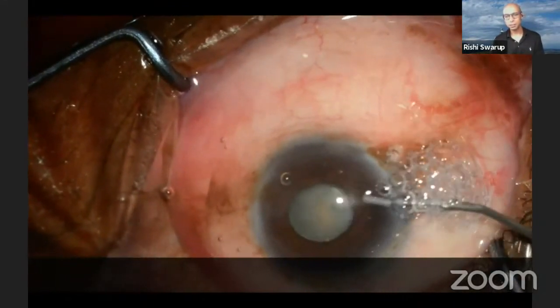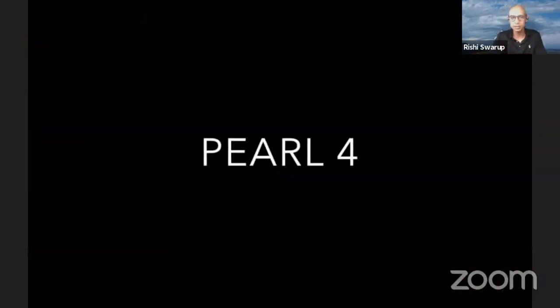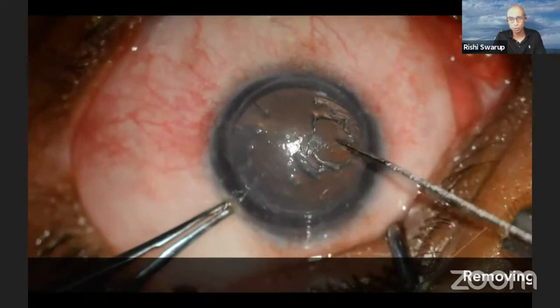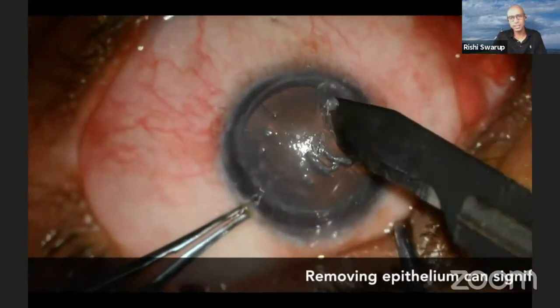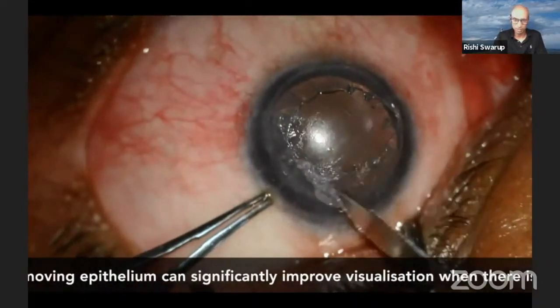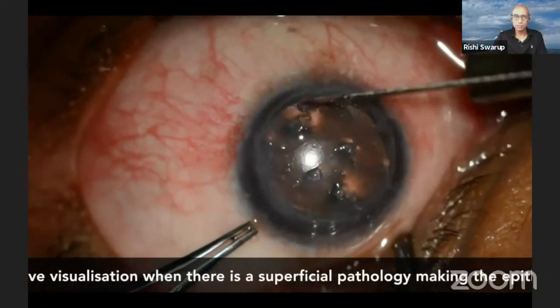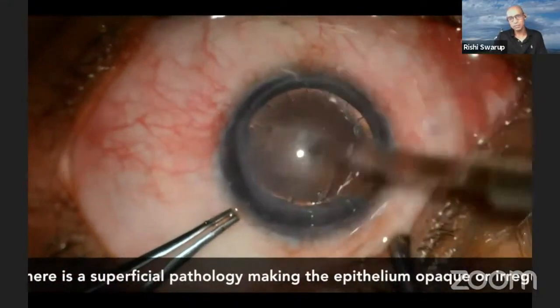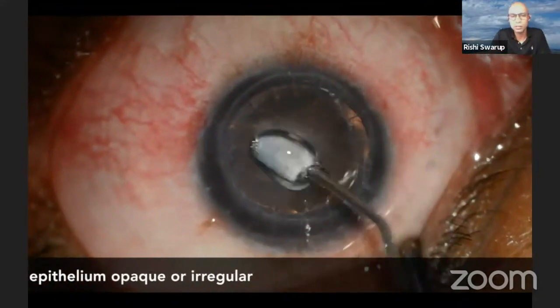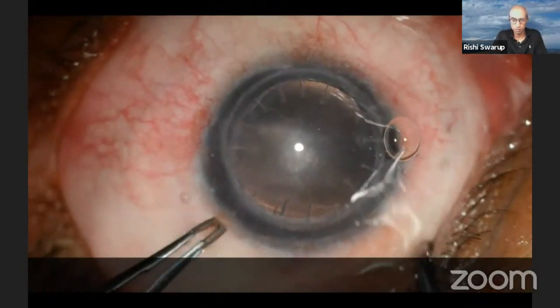Final tip to improve your visualization is that the epithelium is usually your friend, but there are some conditions in which the epithelium is very opaque and irregular. For example, this is a patient with a gelatinous drop-like keratopathy, and you can see the surface is very hazy. And the moment you remove the epithelium, this patient is a post-deep lamellar keratoplasty, but there was recurrence of dystrophy in the graft. So he needed a cataract surgery. Along with that, we've just done a debridement of the unhealthy epithelium. You can see the view improves, and because we removed all those nodules, he also had a very good visual improvement in his vision because of removing the surface irregularities from the subepithelial layer.